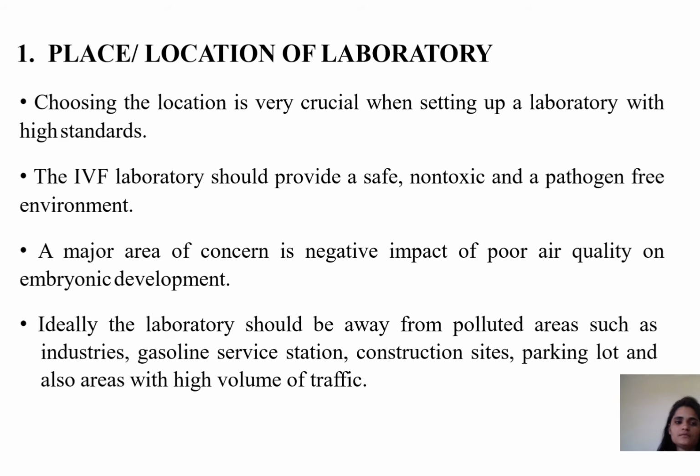The place, location of a laboratory. For choosing the location, it is very crucial for setting up a laboratory with high standards. The IVF laboratory should be safe, non-toxic, and pathogen free environment. It should be stable, with good air quality, non toxic also. The major area of concern is negative impact of poor air quality on embryonic development.